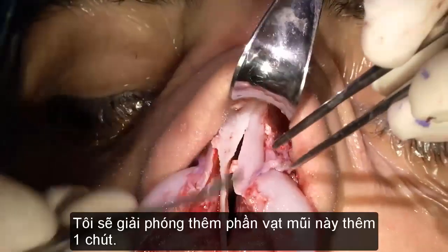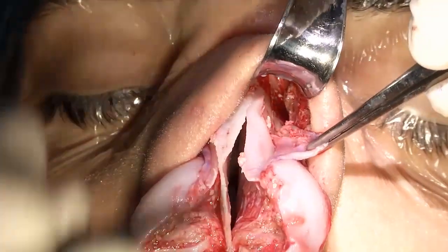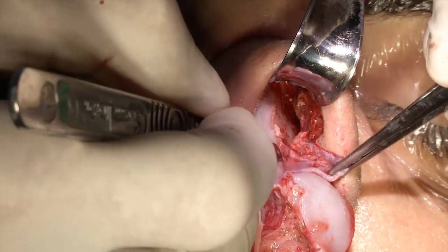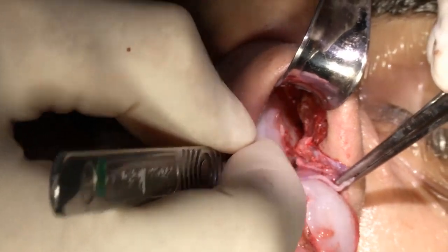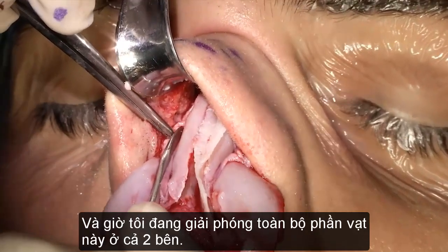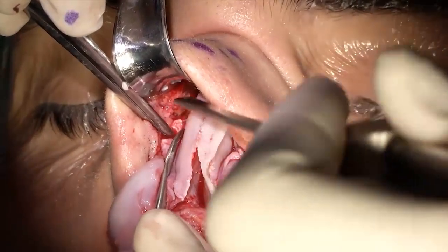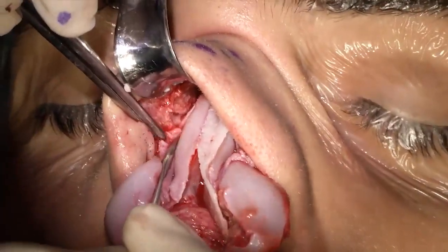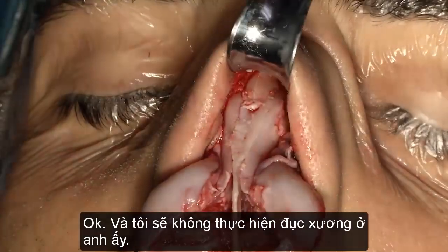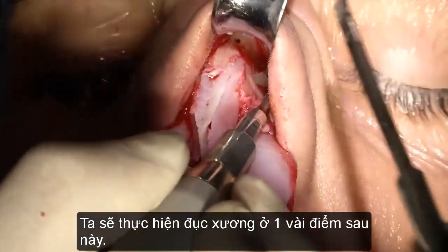Knife? Demo. I'm just freeing this flap a little more. I'm freeing completely this flap, frankly, on both sides. Okay, I'm not going to do osteotomy in him. We will do some osteotomy at some point. It's not that I don't want to show you.